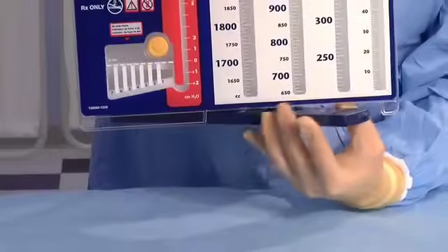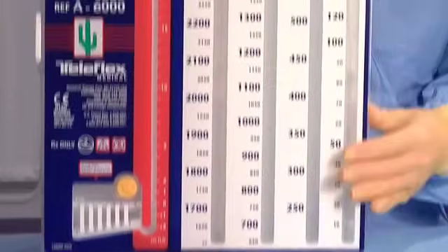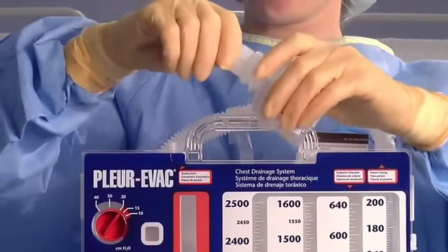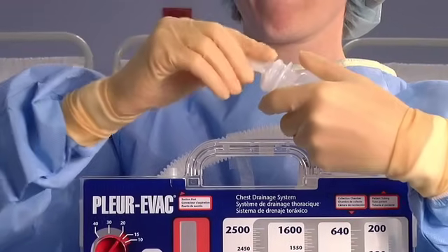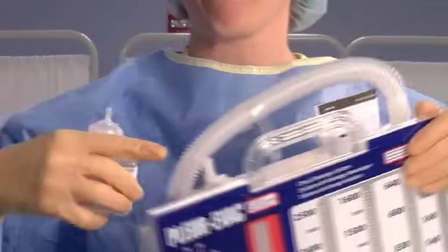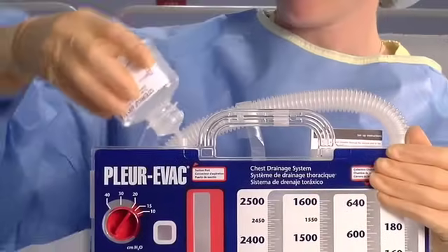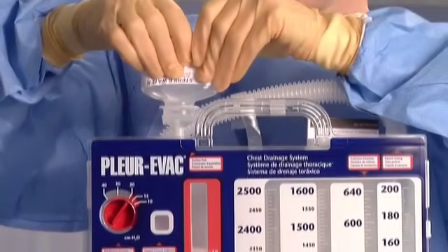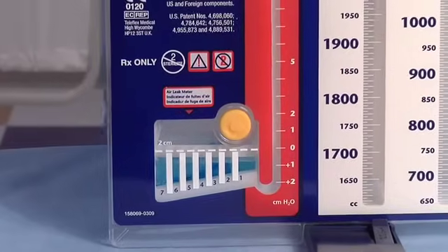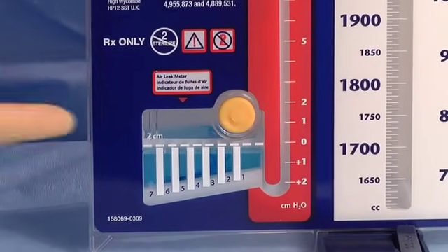To begin, activate the swivel floor stand at the bottom of the unit. Use the sterile bottle on top of the unit to fill the water seal chamber. Open and twist to break the bottle seal. Attach the exposed tip into the suction port. Squeeze the bottle repeatedly until fluid is inserted into the unit. Fluid will come up to the 2 cm line and will turn blue when inserted.